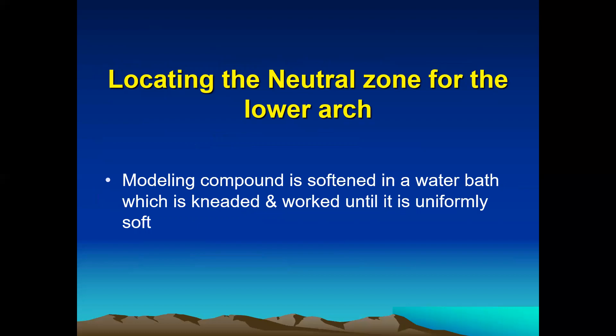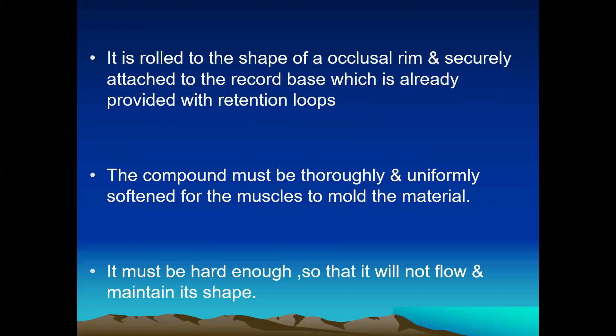Now we discuss locating the neutral zone for the lower arch. First, modeling compound is taken and softened in a temperature-regulated water bath. The usual kneading is done and it is worked until uniformly soft. The softened impression compound is then rolled to the shape of an occlusal rim and secured to the record base which is already provided with the retentive loops. The impression compound must be thoroughly and uniformly softened for the tongue, cheek, and lip muscles to mold the material to the neutral zone. It must be hard enough so it will not flow and maintains its shape.